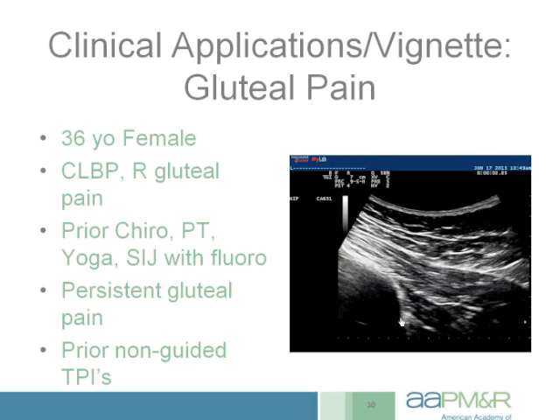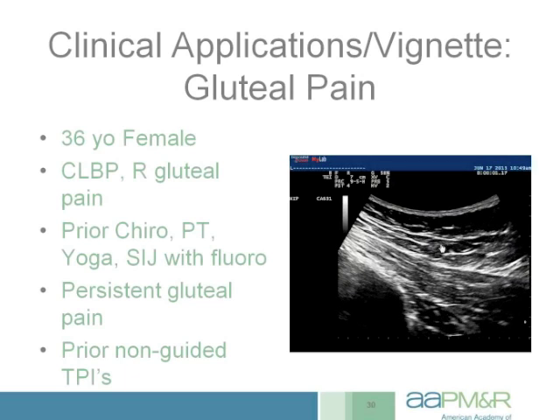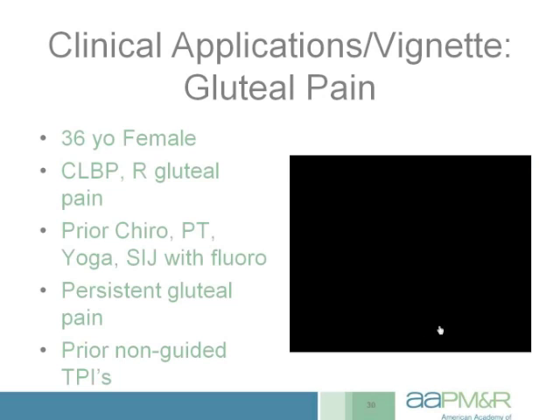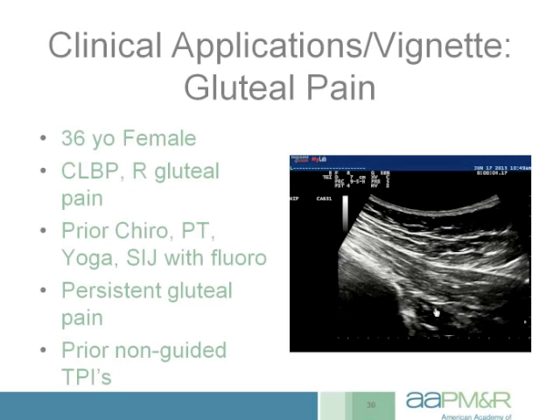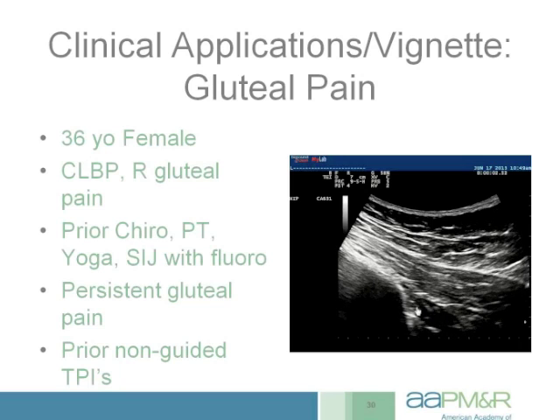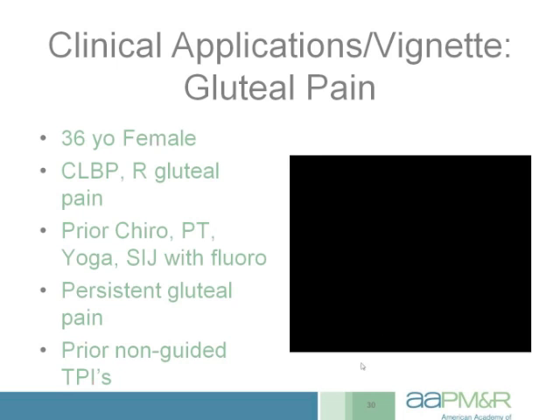So this is the lateral aspect of the sacrum, just below the sacroiliac joint. We have skin and subcutaneous tissues here. The gluteus maximus muscle is sitting here more superficially. And what I'm doing here with the patient, with the help of my assistant, is we flex their knee to 90 degrees, and with them in a prone position, we're internally and externally rotating the hip. And you'll notice that the piriformis muscle has much more excursion in that situation, and it really helps define the appropriate tissue planes and where you want to target.